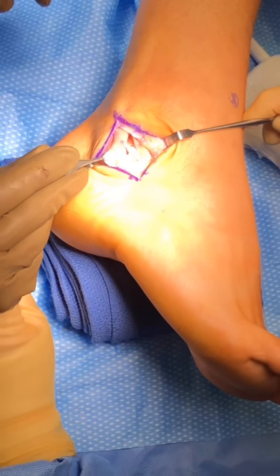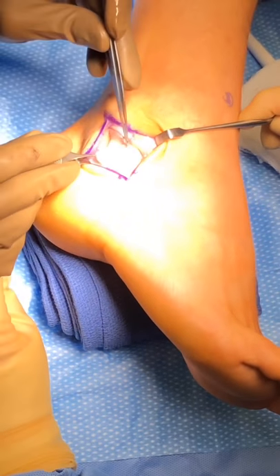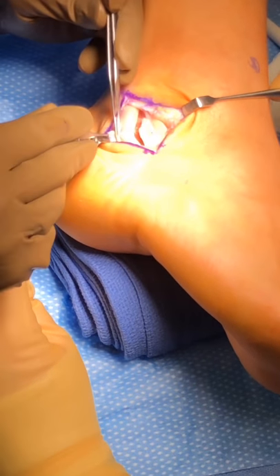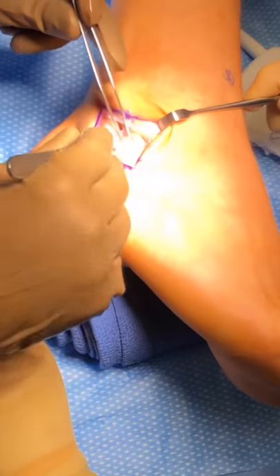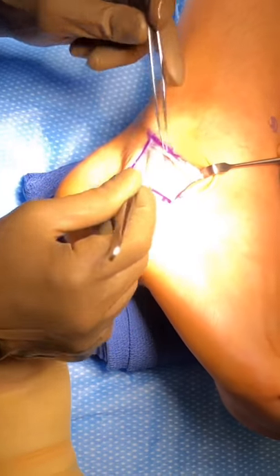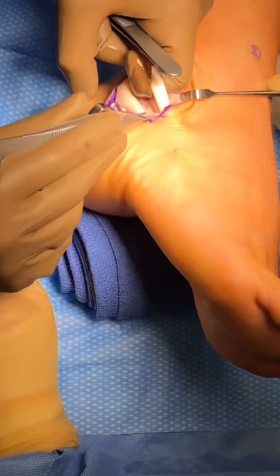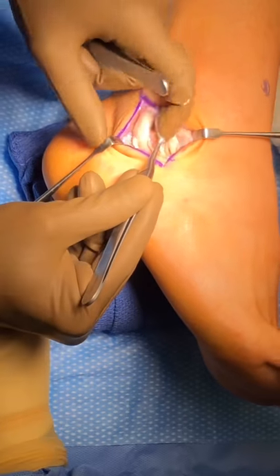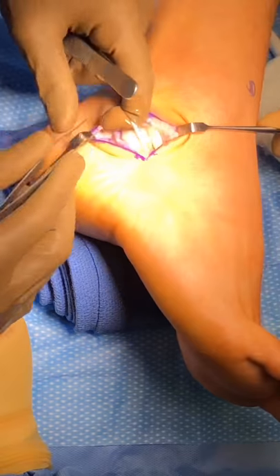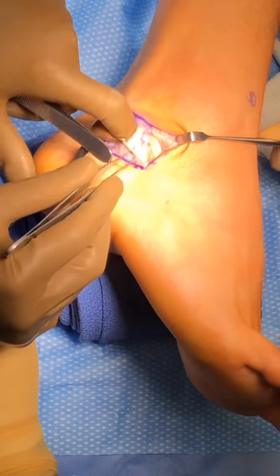See another pickup? Right here. So we will clean that tear up. And then here is the peroneus longus, or peroneus brevis, excuse me. And you can see this overall looks okay. It's a little bit beat up, and there's this little accessory band or tear of the, looks like actually a tear of the peroneus longus, which we'll clean up as well.